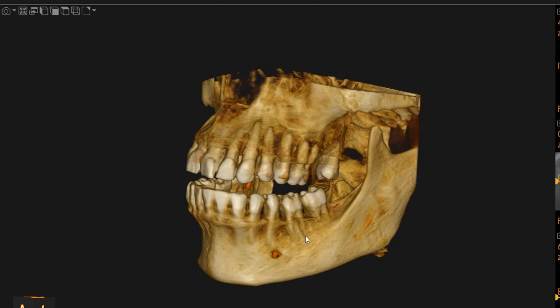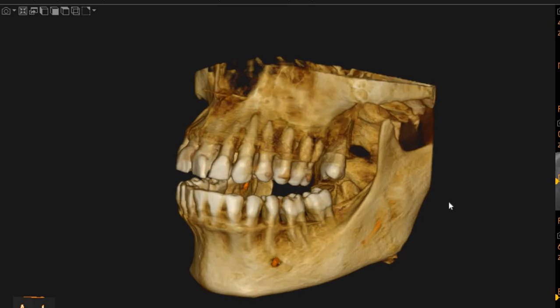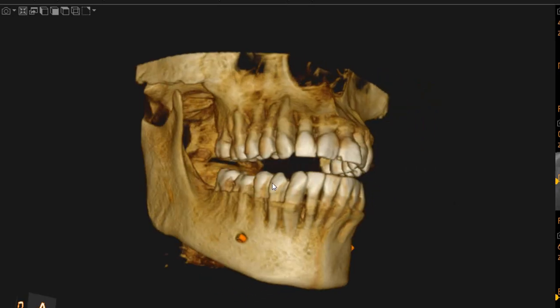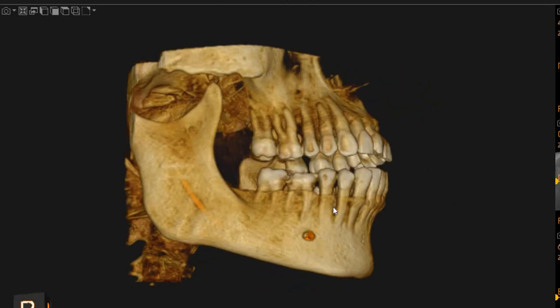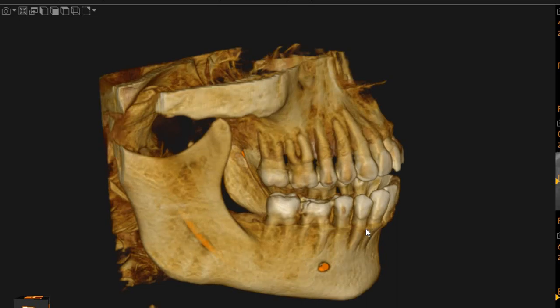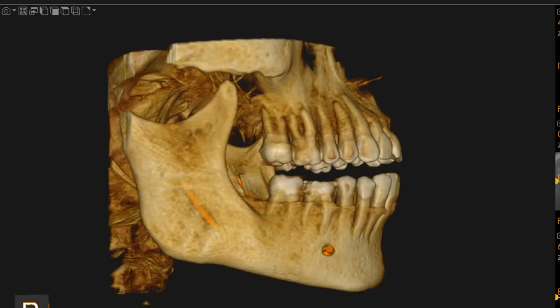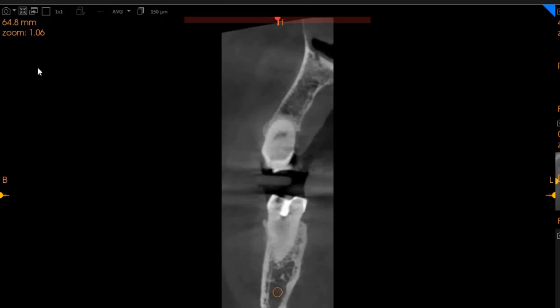Hello and Asalaamu Alaykum. I'm Truscan Diagnostics. This is the CBCT organization that you had requested. The area of interest is the lower right 6. This is the transaxial view.